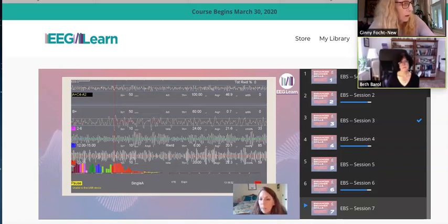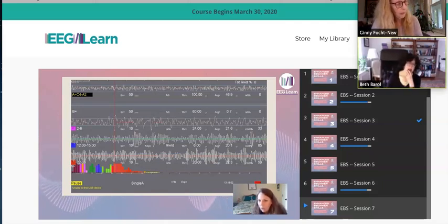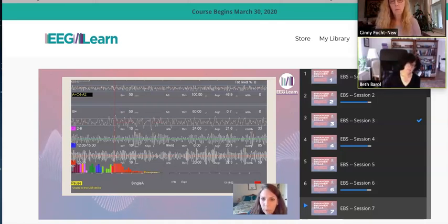So then that means we're going to put the main emphasis of our training on the fast frequency beta. So we've got 22.3 microvolts average amplitude. I'm going to set that limbo bar at 20 microvolts. So at least they got to make less than what they've been making to get a beep. And again, just as a reminder, the person will be getting a beep anytime there's a green line in the reward filtered band and no red line in either one of your inhibit bands.